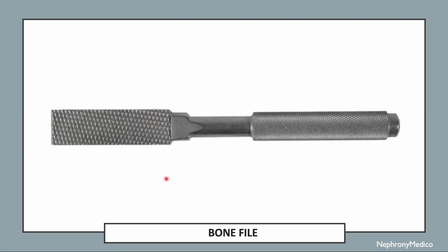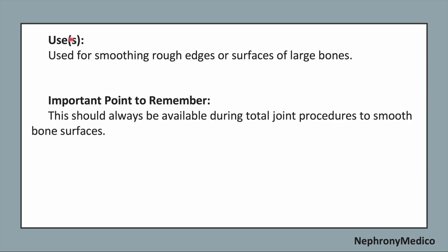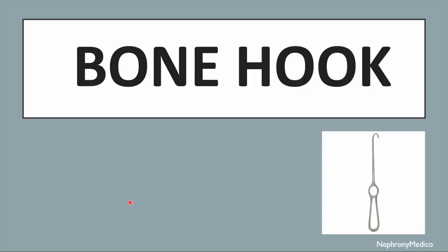Let's talk about bone file. This is a picture showing bone file. The other name of this instrument is rasp. It is a cutting and dissecting type of instrument. Identifying points: a single handle instrument with a flat end with serrations in a crisscross pattern. Use: it is used for smoothing the rough edges or surfaces of large bones. Important point to remember: this should always be available during the total joint procedures to smooth bone surfaces.